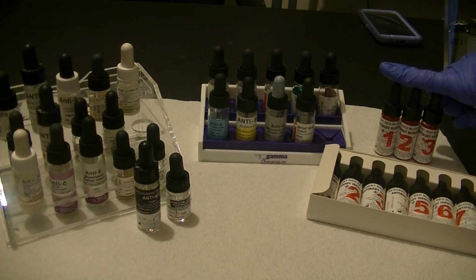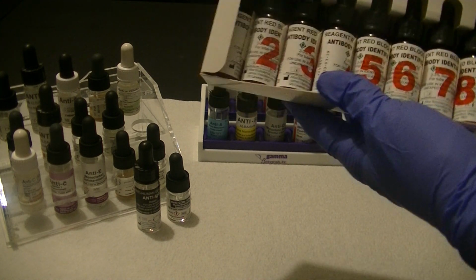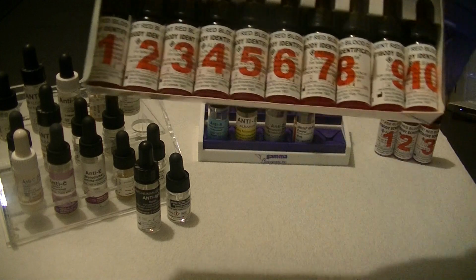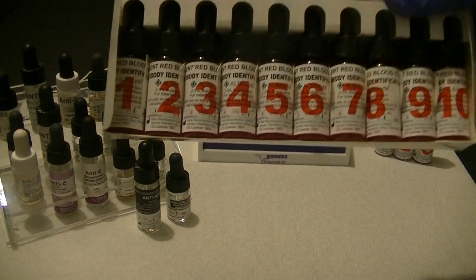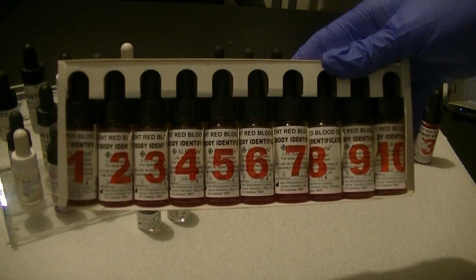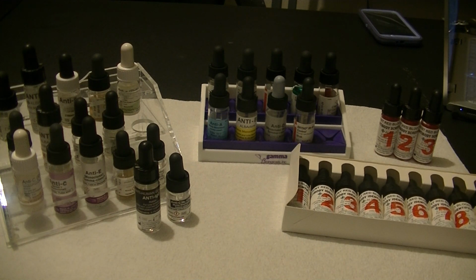If we do detect any antibodies there, we can't tell exactly which antibody it is using just 3 cells, so we will actually perform a full antibody panel. There are 10 different reagent red blood cells in this test, and using these 10 different cells, each one mixed in a separate tube with patient plasma, can help us determine what exact antibody that person has in their plasma. The last type of reagent that we cover in the lecture for Chapter 3 are known as potentiators.